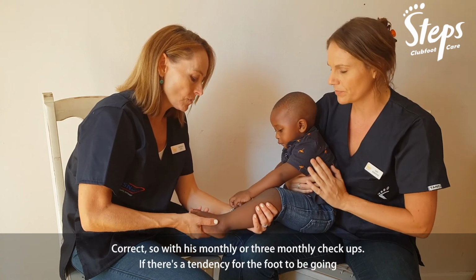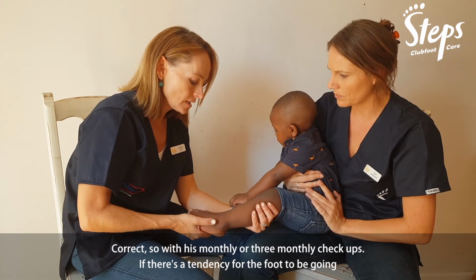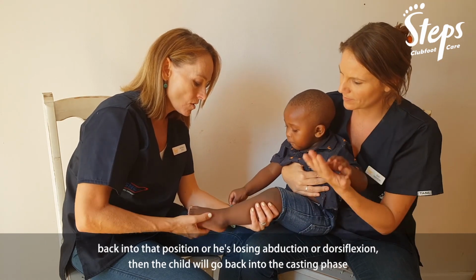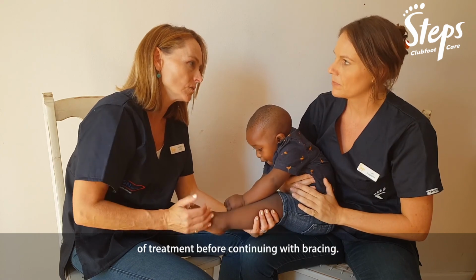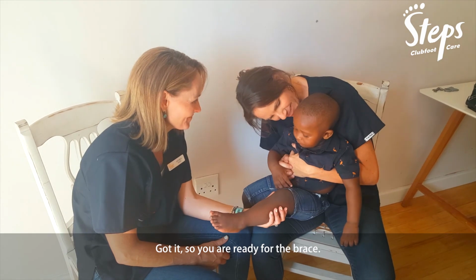Correct. I got it. So with his monthly or three-monthly checkups, if there's a tendency for the foot to be going back into that position, or he's losing abduction or dorsiflexion, then the child will go back into the casting phase of treatment before continuing with bracing. Got it. So you are ready for the brace.